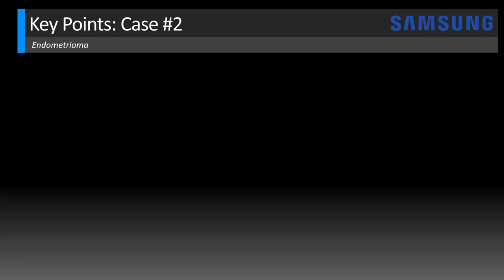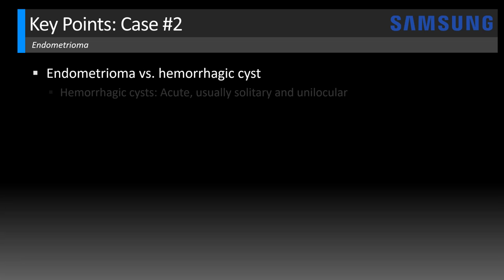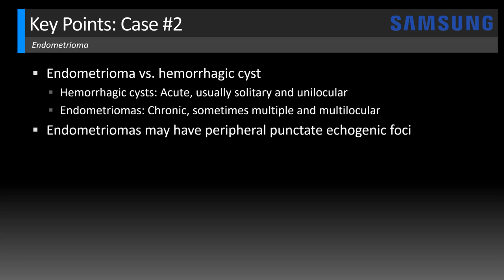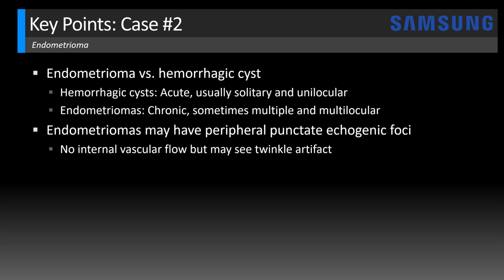Let's briefly review key points for case number two. How do you differentiate endometriomas and hemorrhagic cysts? Hemorrhagic cysts will have that reticular pattern of fine thin intersecting lines. They tend to be acute, resolving within 8 to 12 weeks, and are usually solitary and unilocular. Endometriomas, on the other hand, will be chronic — persisting beyond that initial follow-up for years — and can sometimes be multiple or multilocular. Endometriomas can also have peripheral punctate echogenic foci with no internal vascular flow, though you may see twinkle artifact. In this case the peripheral echogenic areas were more irregular, almost like mural nodularity, but had no internal vascularity, and at surgery this mass proved to be a benign endometrioma.